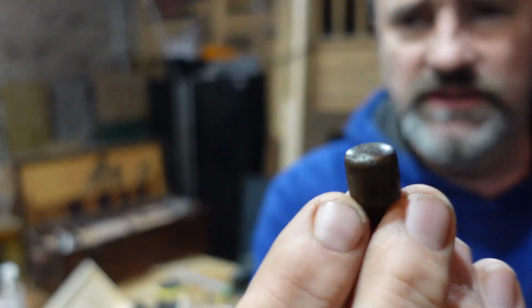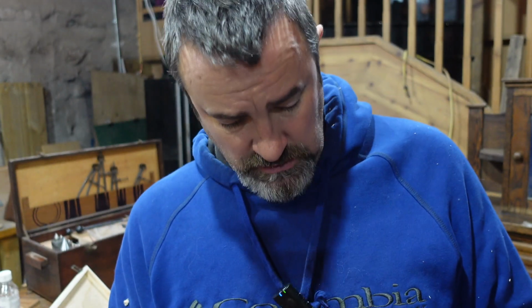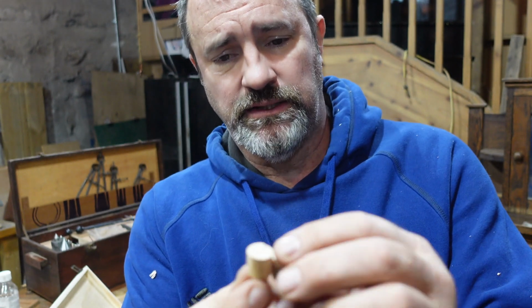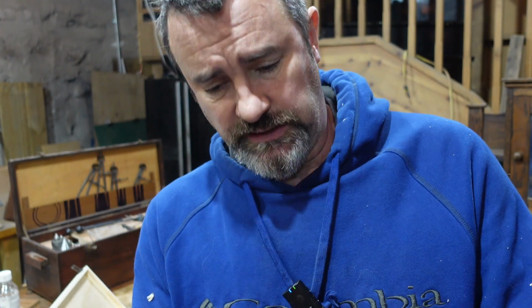So we were missing a couple of these, which are the shelf supports. So I've just taken some ash and turned a couple more, which I'm going to shape up now on the sander and stain to be the same colour.